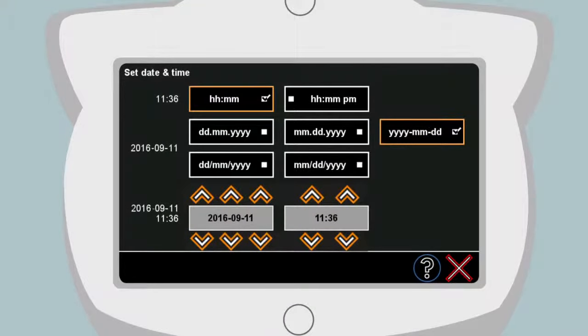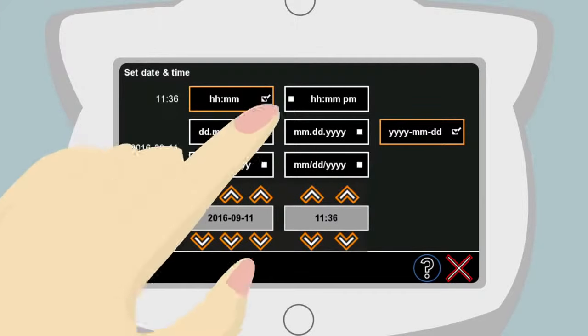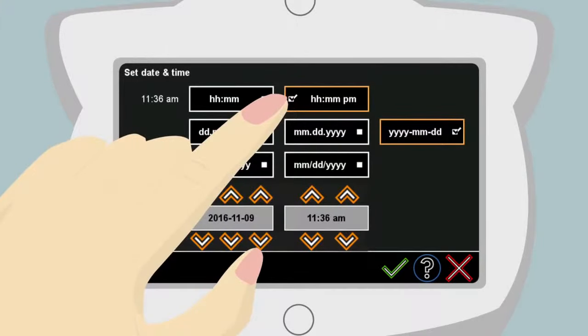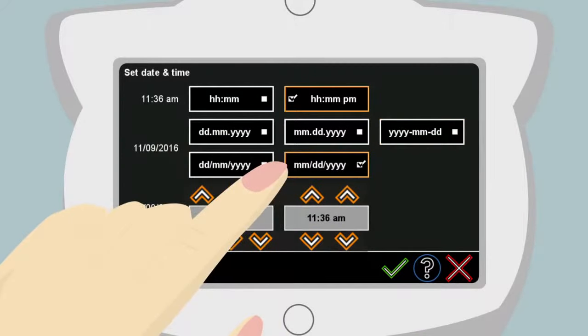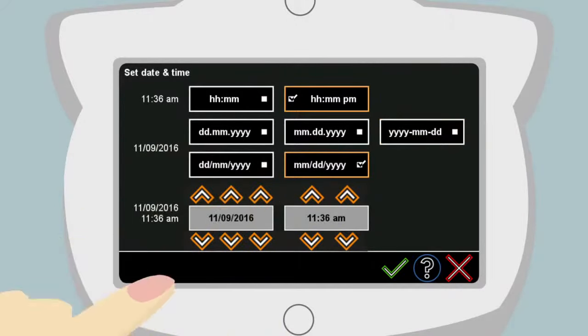The initial screen asks Anna to set the date and time. Here she simply touches the hour, minute, PM selection. Then she touches the month, slash, day, slash, year selection.